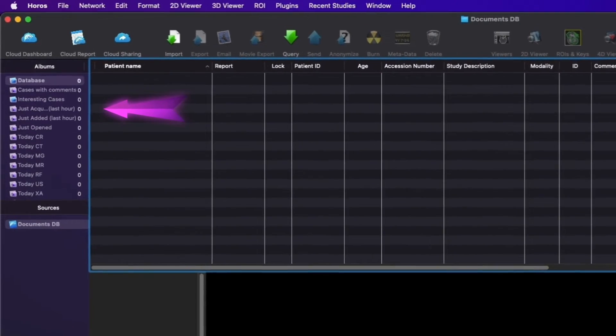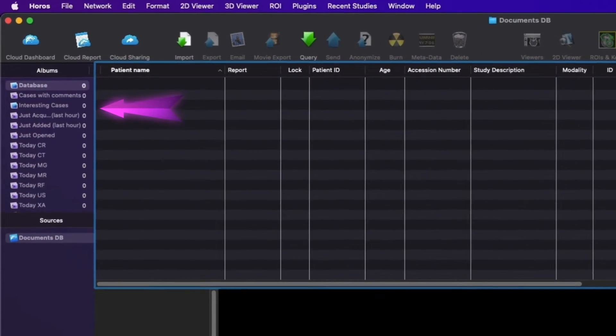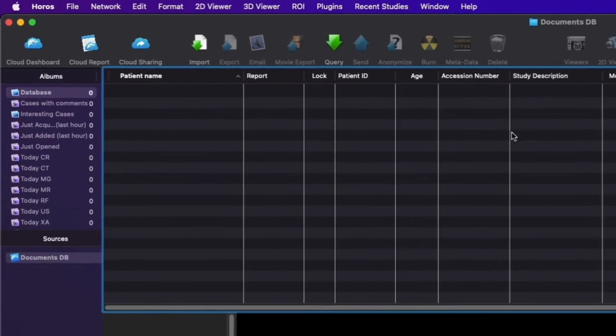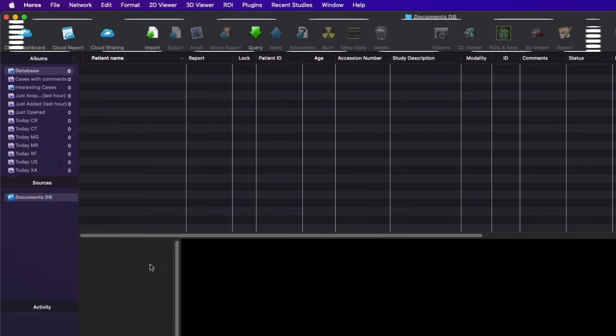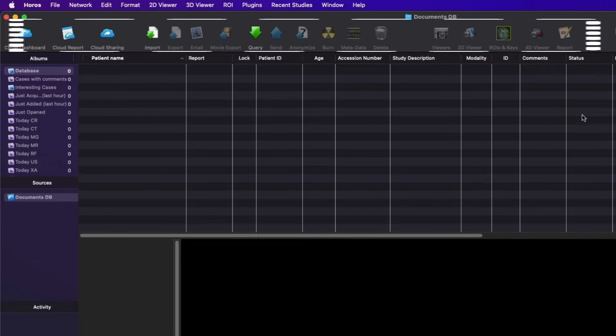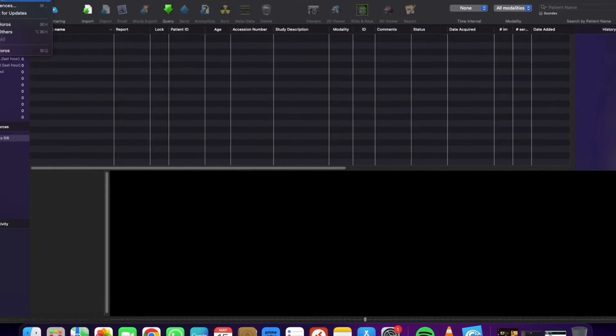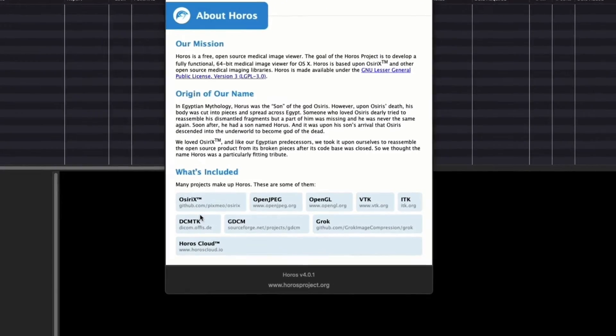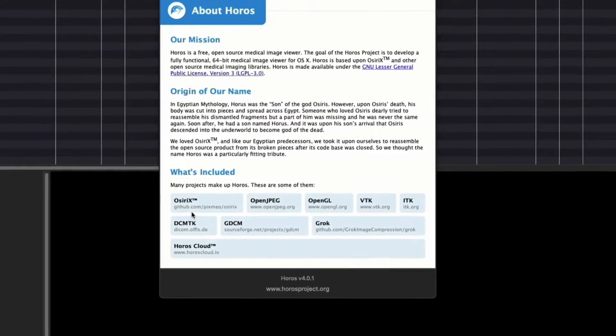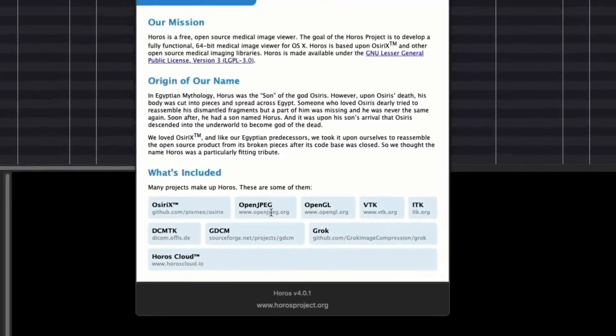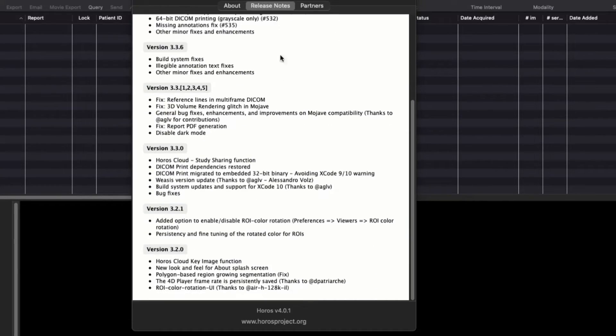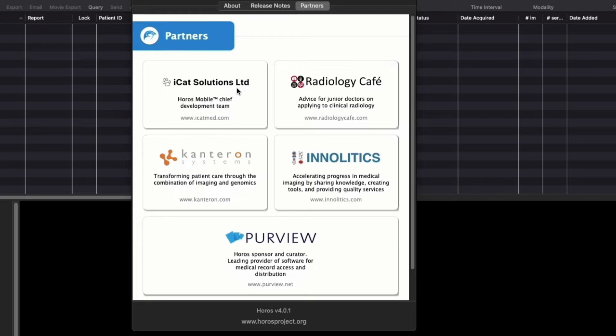The left-hand panel displays the study image album. In the top menu, you have options to get more details about each tool. The Horos project was previously known as Osirix, which is now a paid software, while Horos remains free for general use.